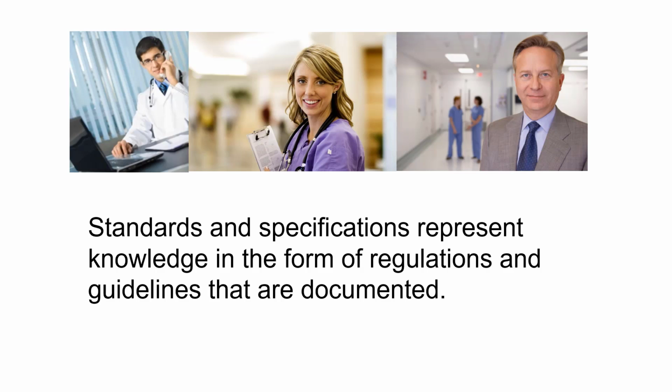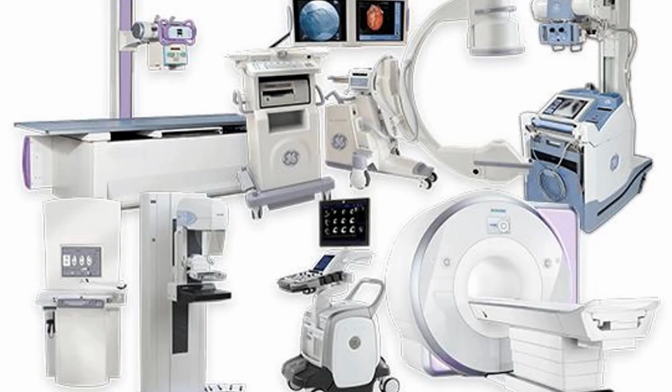Standards and specifications represent knowledge in the form of regulations and guidelines that are documented. The implementation of standards varies dramatically from facility to facility. Policies and procedures and protocols for medical image vary from department to department.